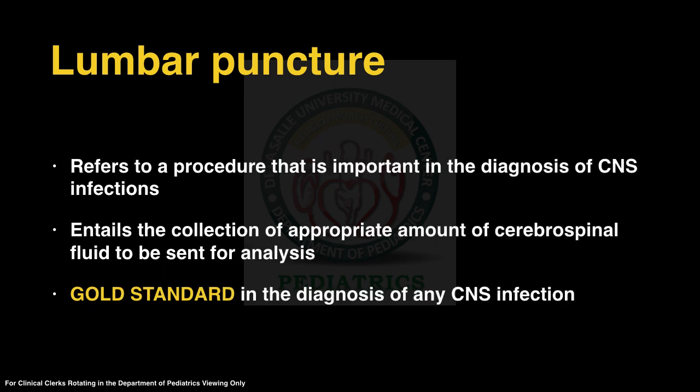Lumbar puncture refers to a procedure that is important in the diagnosis of a CNS infection. It entails the collection of appropriate amount of cerebrospinal fluid to be sent for analysis. Lumbar puncture remains to be the gold standard procedure in the diagnosis of any CNS infection.